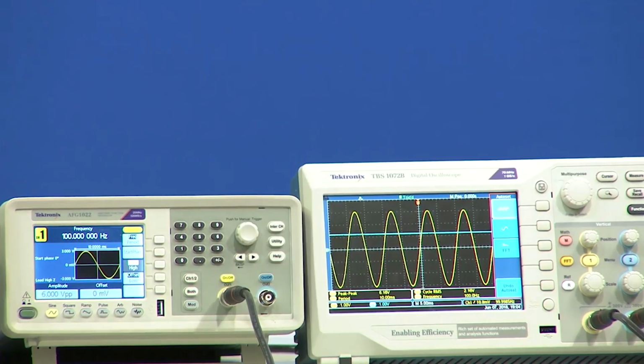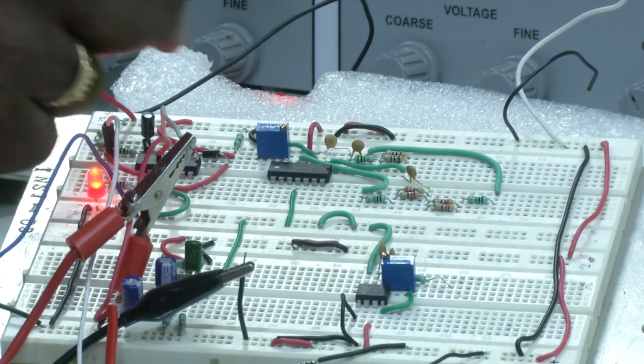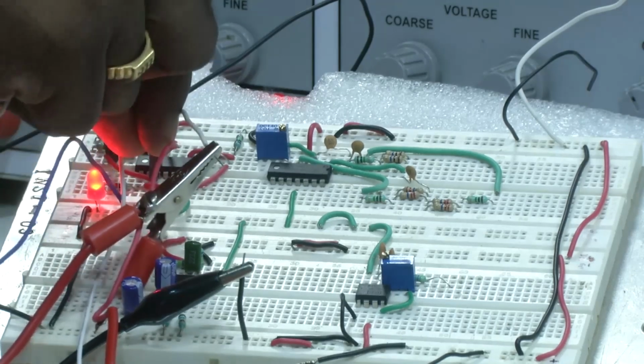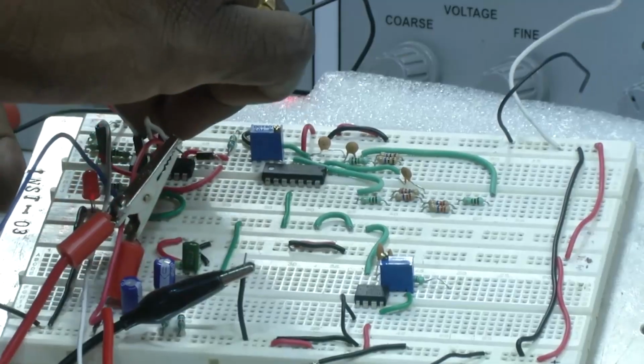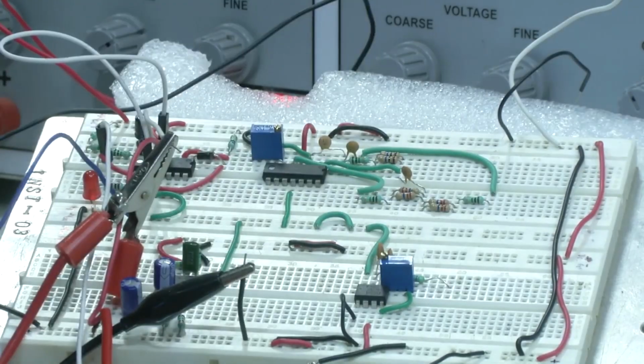So when we look into the board, we will connect the positive terminal to the input terminal. So positive in this case is the 10th terminal. So 1 2 3 4 5 6 7 8 9 and 10. So this terminal I am connecting to the input, right, whereas the other terminal I should connect to the output.